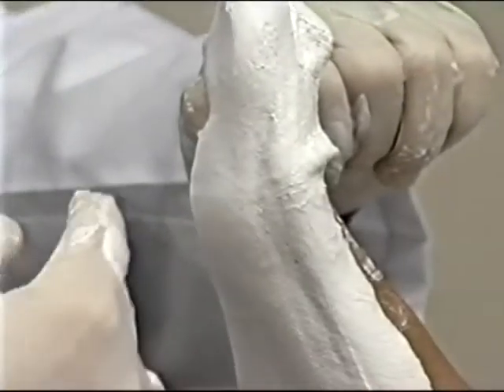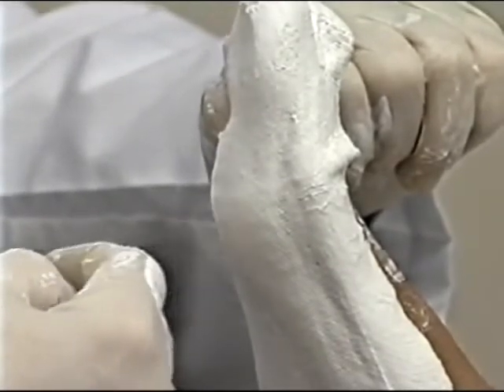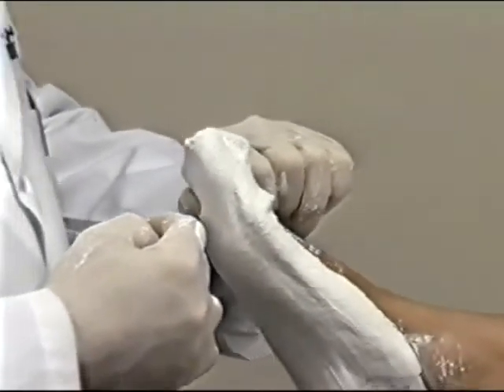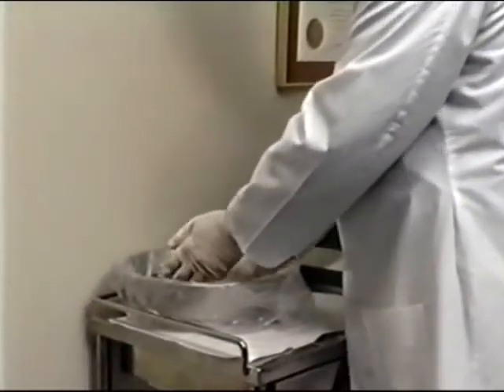The last part of the plaster to dry is usually under the first metatarsal, and tapping there should allow you to know whether the plaster is dry or not. Once the plaster is dried, release the foot and place it in a relaxed position. Wash your hands or gloves in water to remove the dried plaster.